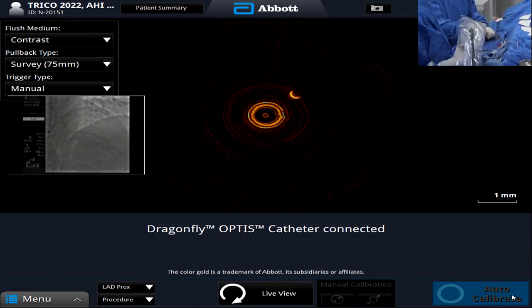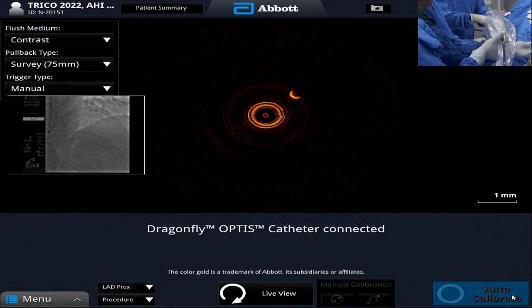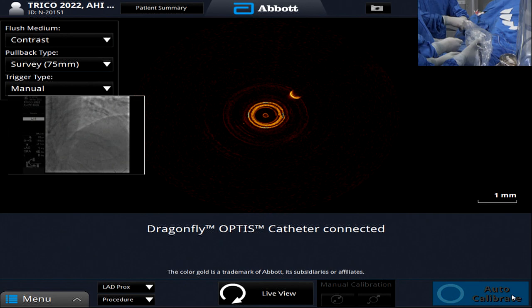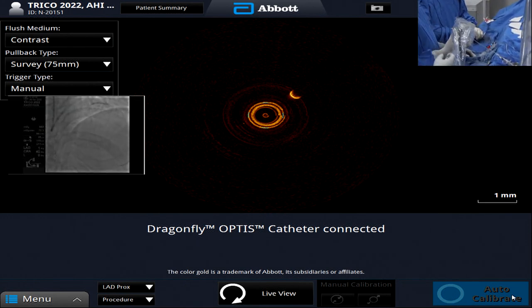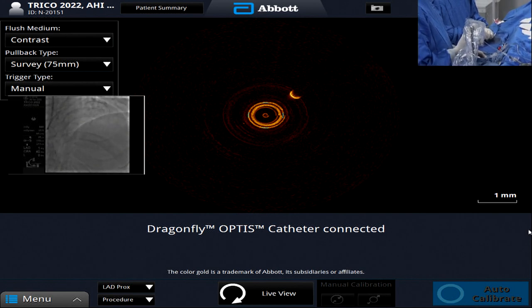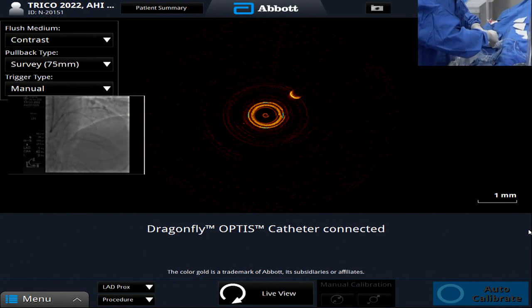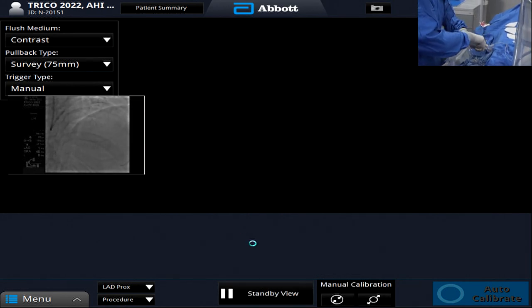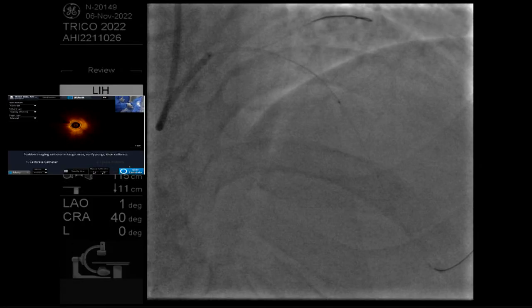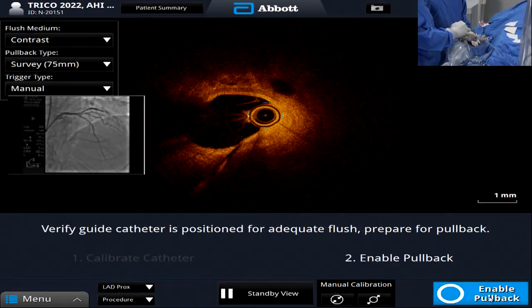Are we going to get an opportunity to use a trick to see the ostium of the left main with OCT, maybe a bumper wire or a guide extension? It would be a really lovely illustration to show ostial disease by OCT. Yes. If you want to identify the ostial disease, we sometimes use a telescope extension catheter, because we can identify the ostial lesion from the backflow contrast very well. But it depends on the size. In Asian people, the left main is not so big, so we can identify.